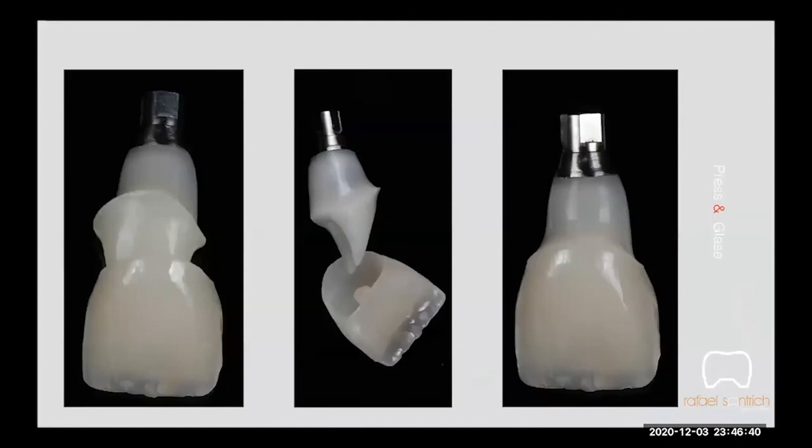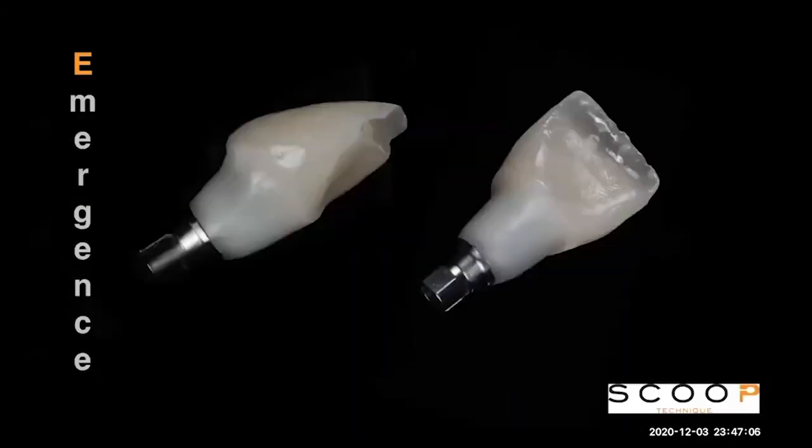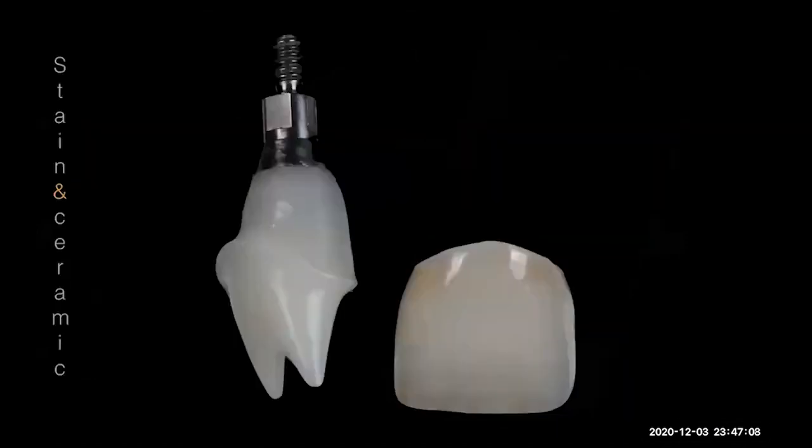Then we press. The fit is really good. So we can see the emergence profile of the abutment. We can see the fit of the crown. We can see all the characteristics that we place from the palatal of the tooth, the buccal characteristics, the crack lines, all the effects that we need to match the tooth, because the tooth is really, really hard. We can see the emergence profile too. And we can see here the crown is already done.